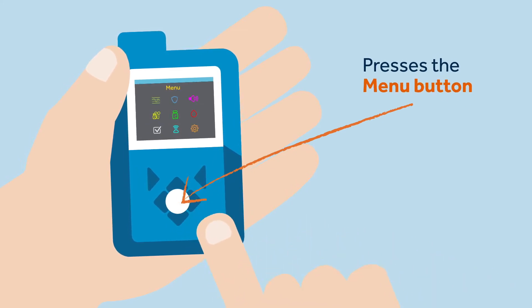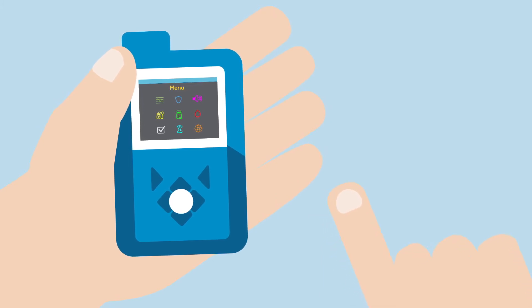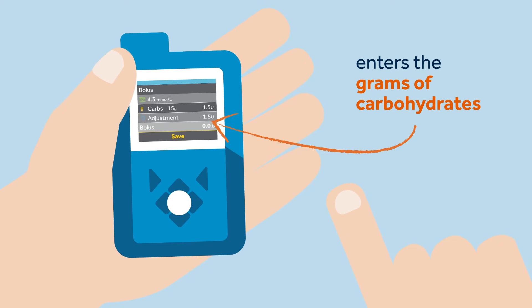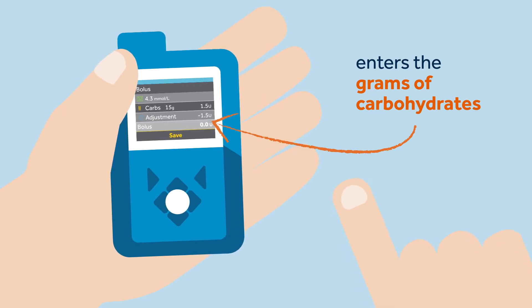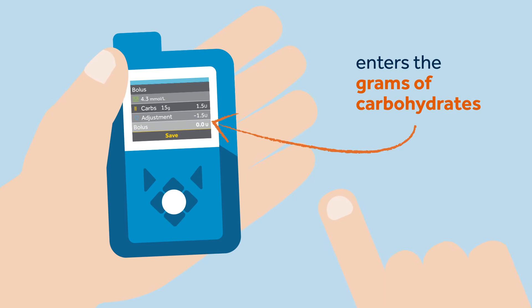When Sophie is using the SmartGuard feature and she wants to deliver the bolus, she should press the Menu button to enter the bolus menu or open the bolus screen. She then enters the grams of carbohydrates that she plans to eat. If she is using the SmartGuard feature, her most current sensor glucose (SG) will automatically populate.